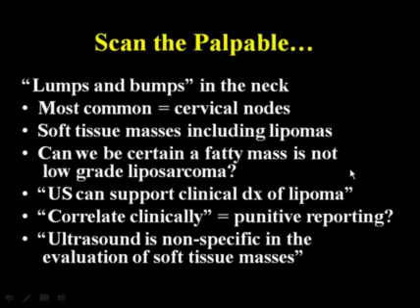I also read CT, and I know that enhancement of soft tissue components is one of the diagnostic features of a low-grade liposarcoma. So in the literature, I've looked up this topic frequently, and most of the literature has statements such as ultrasound can support the clinical diagnosis of lipoma. A lot of people use the correlate clinically disclaimer in their reports. I sometimes think of this as punitive reporting.